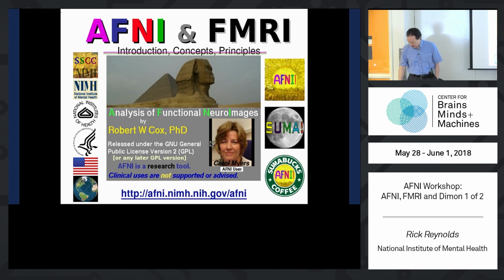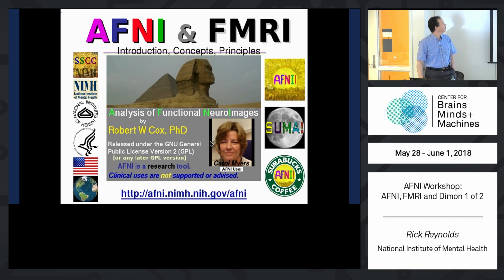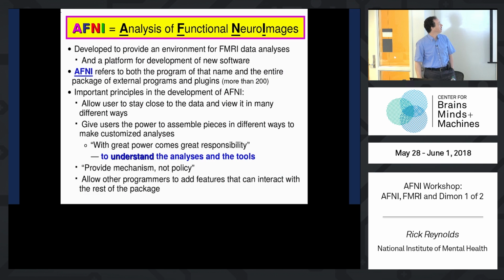So here you see Bob has found lots of logos to show you. That's the main purpose of that slide, I think. So the purpose of the software, again, is mostly to provide an environment for fMRI analysis and for development of new software. If any of you are software developers, it's pretty easy to write a new piece of software that works with AFNI, especially a plugin that connects to the AFNI GUI. It's very simple to write that aspect, and then you can do whatever you want with the data that you access via the plugin.